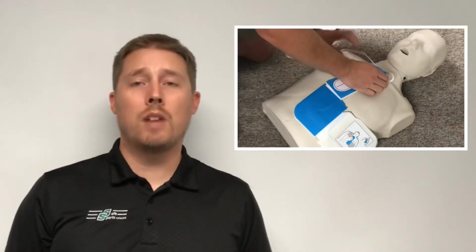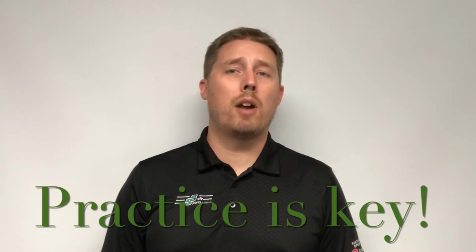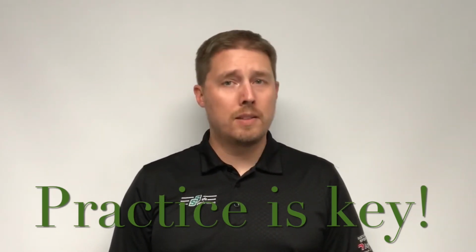There are many different brands of AEDs, so it's important to become familiar with the type of AED at your venue. Practice is key. Coaches and teams are encouraged to practice and review their emergency action plans with their Safe Sports athletic trainers, local EMS, and other game officials regularly.